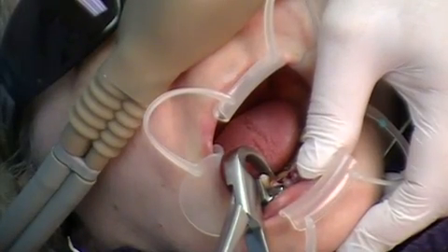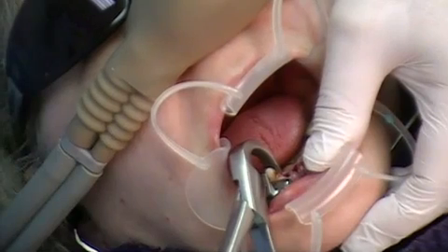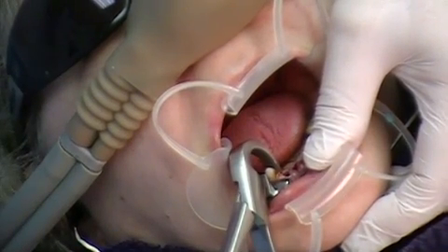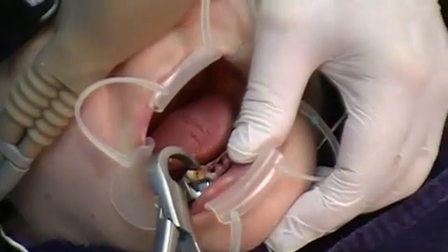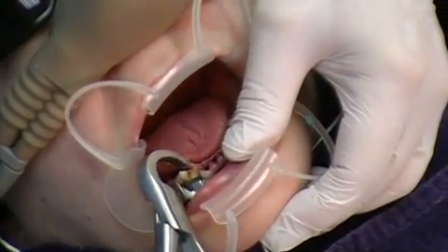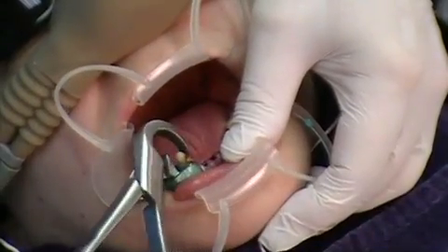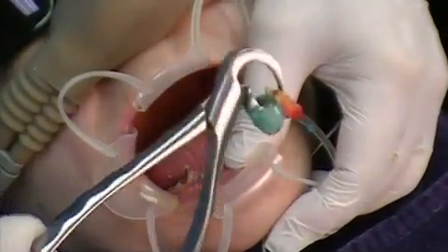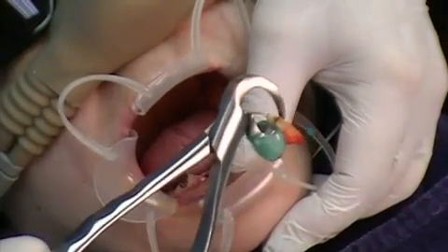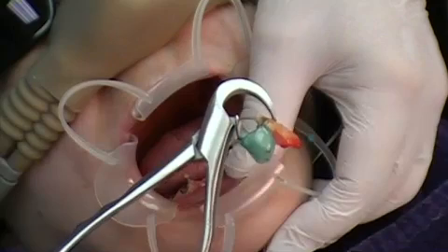Now I can feel it giving a little bit — this is a real good close-up shot. Remember, this is a cuspid tooth, long root, very, very decayed, and... POP! Wow, amazing! That's a long-rooted tooth that was very badly decayed.